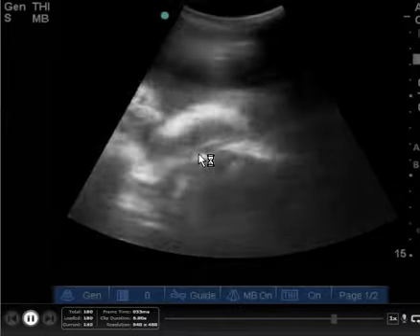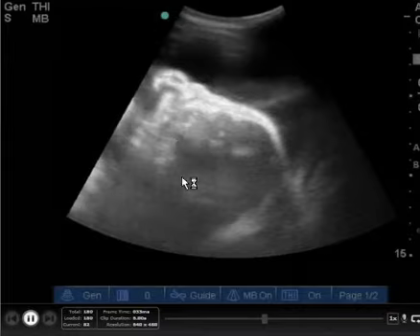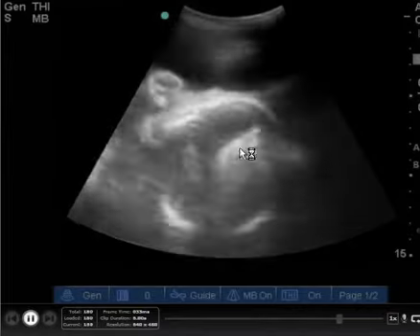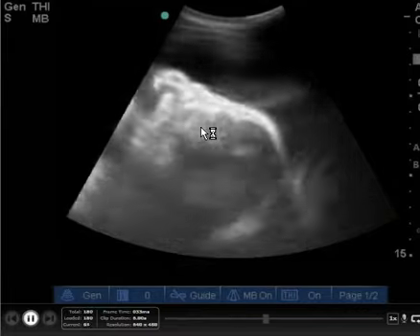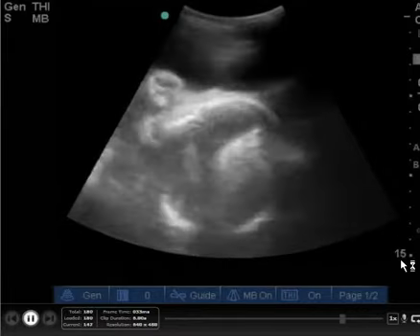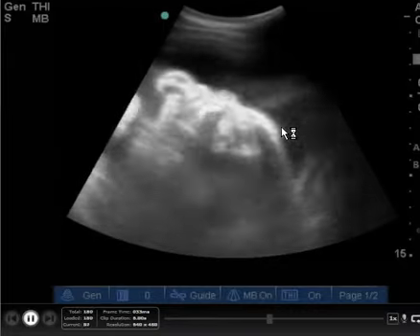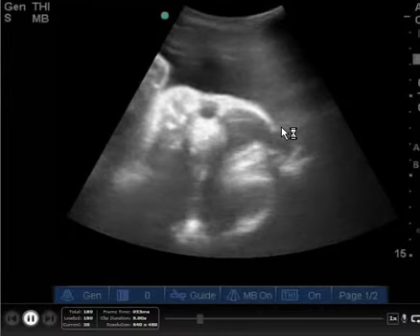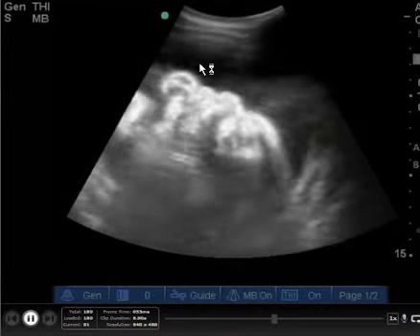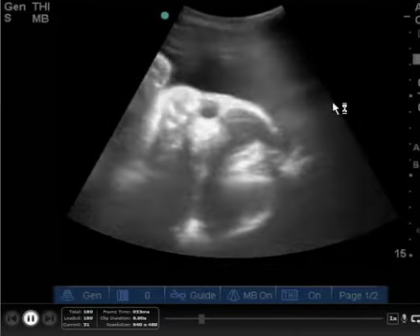Clearly, the patient's pregnant, and there is a large child in the patient's body. So a little bit challenging to get the bladder view, but one thing I would suggest, you see how the depth here is 15 centimeters? I would actually increase the depth a little bit more when they're pregnant. This way you're able to get more around the bigger picture to see if there's free fluid. Now, free fluid in the uterus is expected, but we're looking more about free fluid around the patient.